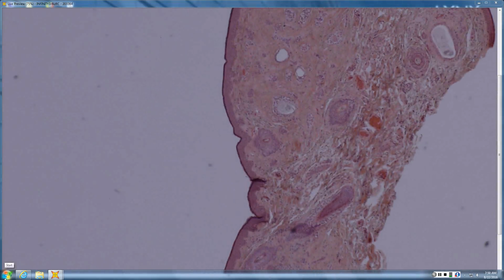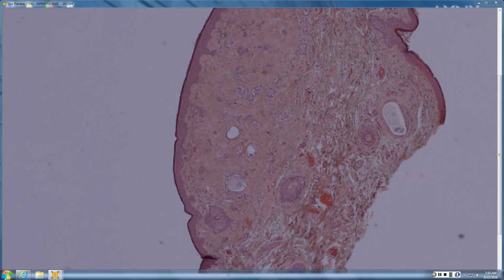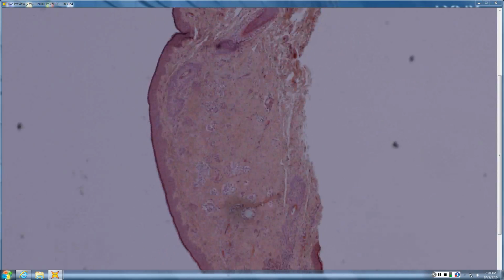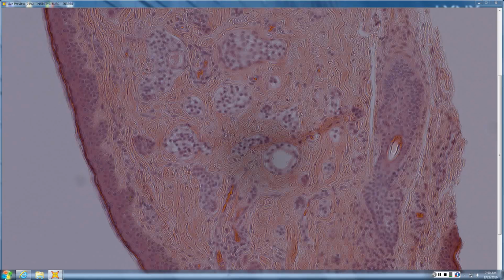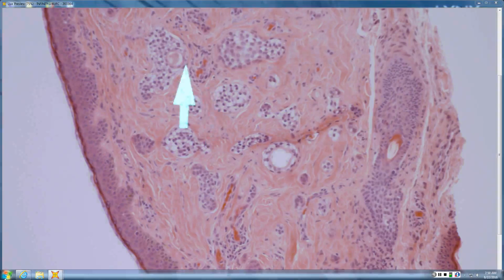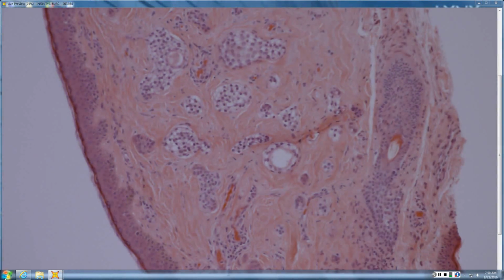Okay. So we're in a Paisley tie differential here. Looks pretty small and well circumscribed. Maybe some clear cell change, as in a clear cell syringoma. So there's definite clear cell change where they're glycogenated. And so they are fat tadpoles, right? Because they're glycogenated in clear cells.